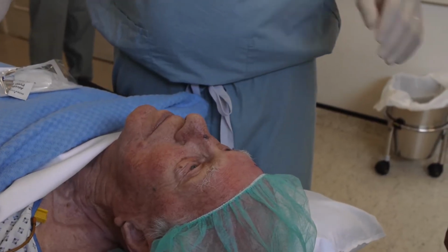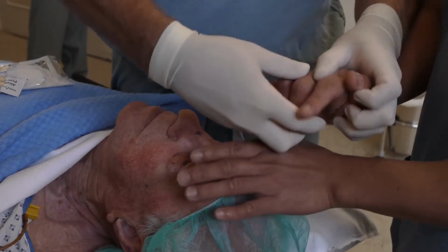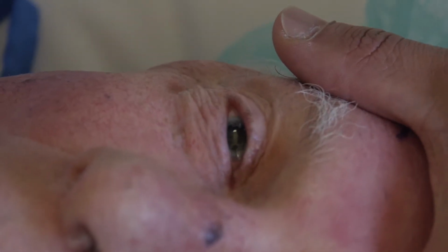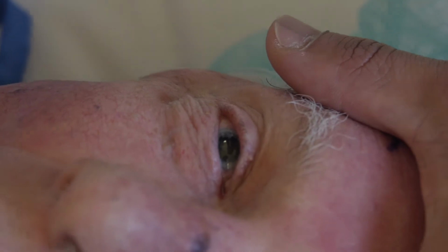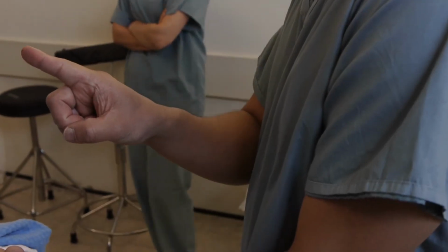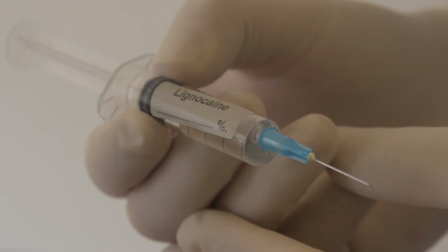So next off, we get the patient to put their eye in the primary gaze. The nurse puts a hand on the forehead to stabilize the head, and the patient is asked to focus both eyes on the nurse's finger straight in front.